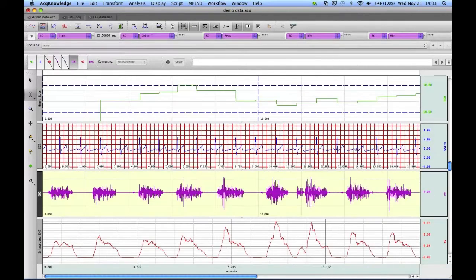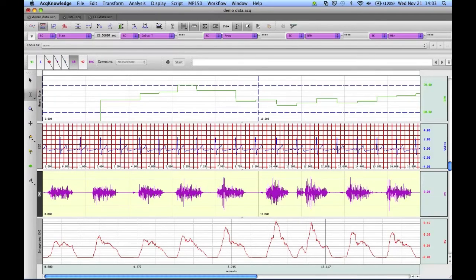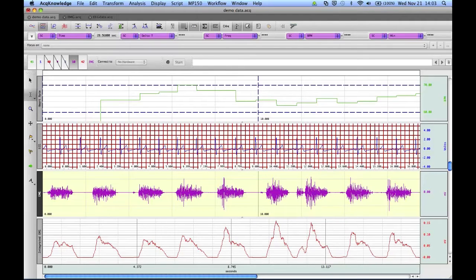And then, once you've got this set up for all the channels you're recording, you can save the whole thing as a graph template file, so you can use it with all your future recordings of the same signals.